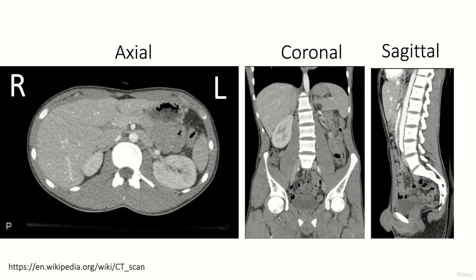On this slide, you can see an example of different cross-sections through a CT scan. On the left, you can see an axial section or slice of the abdomen. In the central image, you can see a coronal slice or section covering a region that shows part of the lung up to the pelvis. And last but not least, on the right, you can find the sagittal slice or section.